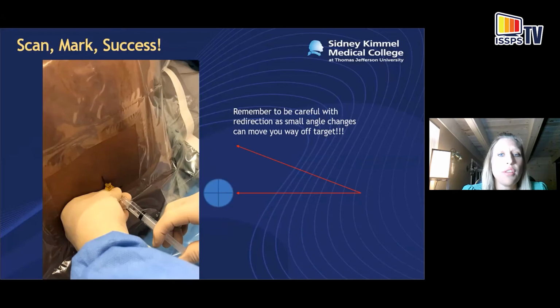It's also important that the skin in an obese patient can move. So it's really important to anchor the skin, because it can move around and you can get lost, especially off of your markings. So it's important to try to anchor with your 2 fingers, is usually what I do, to help secure that space.